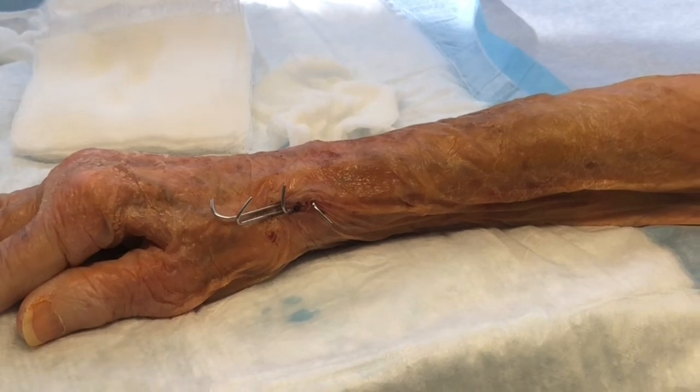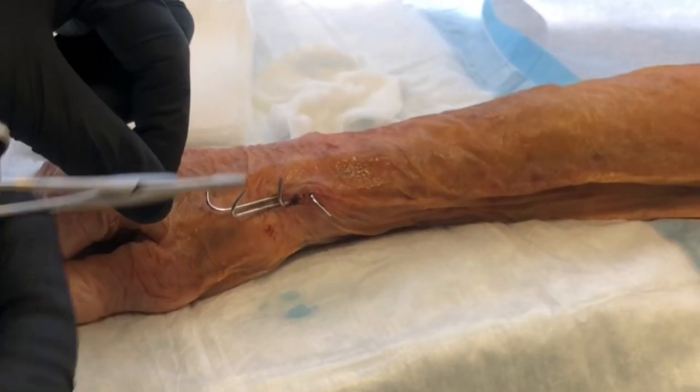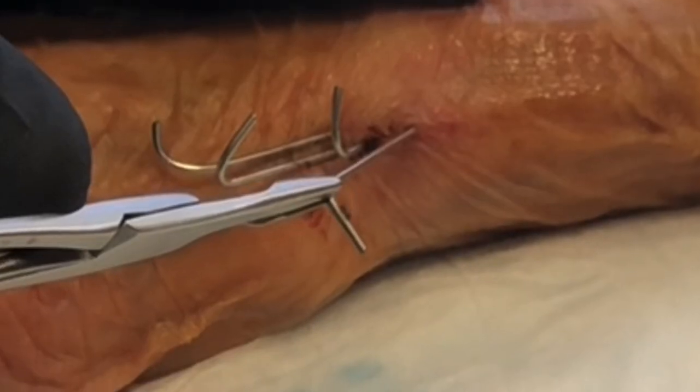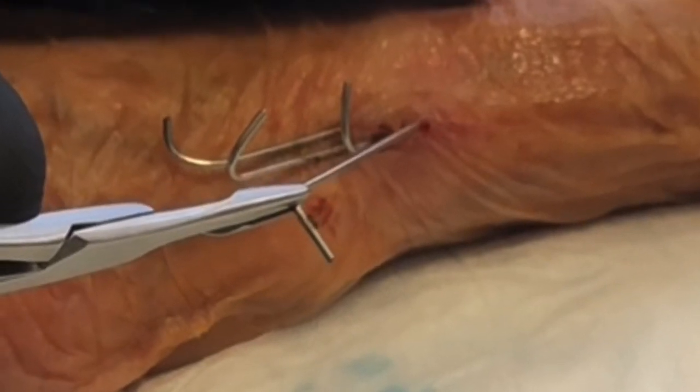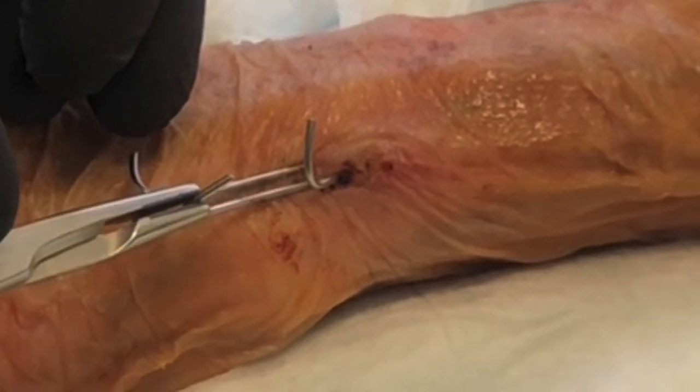I've already prepped the area with some alcohol. These pins are bent like this just to allow me to grab them and pull them out. See, they come right out. Sometimes there's a little bit of bleeding, sometimes I have to rotate them a little bit.